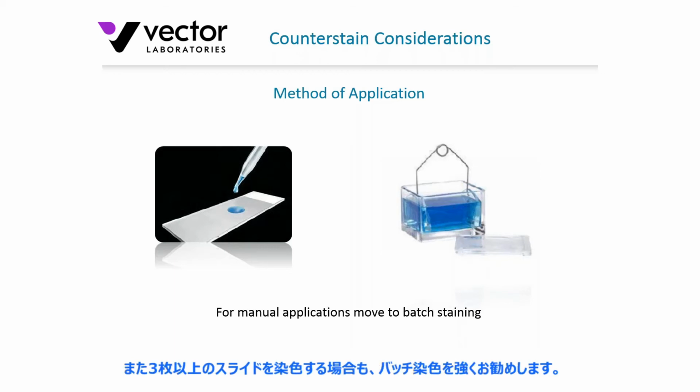Now, certainly if you're working with any more than, say, 3 slides, I would highly recommend using this batch staining method as well to get that consistency and uniformity as well.